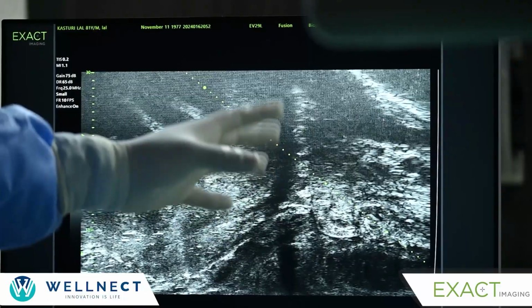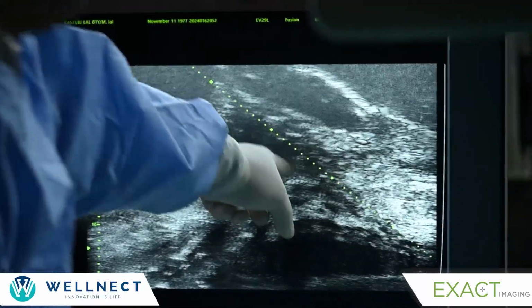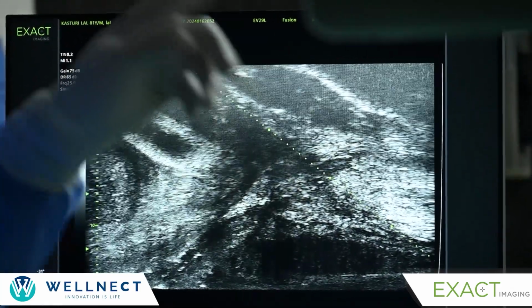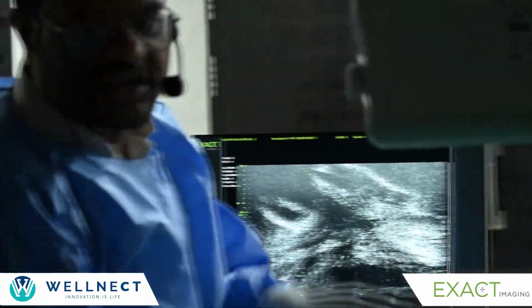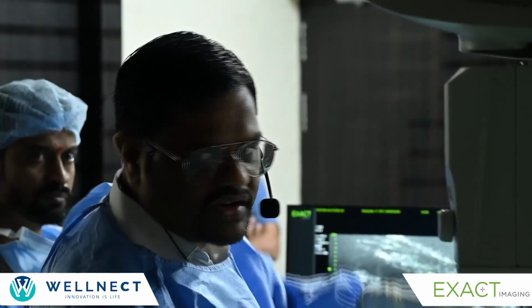Now you ask that patient to do it. Yeah, can you see? Yes. Can you see the sphincter contract? So that is how you can understand whether the patient is doing proper Kegels or not. Okay, so you ask this patient and tell them that the thing that you did now is exactly what you have to do in future as a Kegel exercise. So from this ultrasound you can understand whether he has contracted the proper muscle.